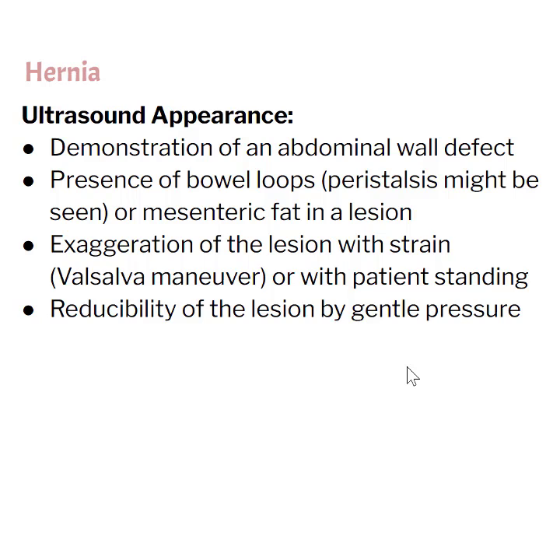But essentially what it is, that pressure that you create in your body to have a bowel movement, is the Valsalva maneuver. And so you need to express to your patient how to create that pressure within their body. Sometimes it's a matter of saying, take a deep breath in and kind of flex your abdomen muscles. That usually helps. Sometimes people get a little aggressive with that and do a full-on sit-up, which then ends up knocking you off where you're looking and is not very good for imaging. So sometimes you need to explain it to them in a different way.